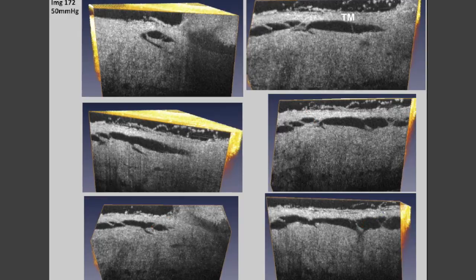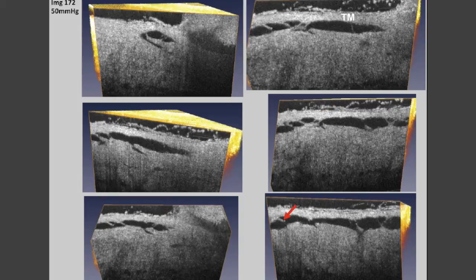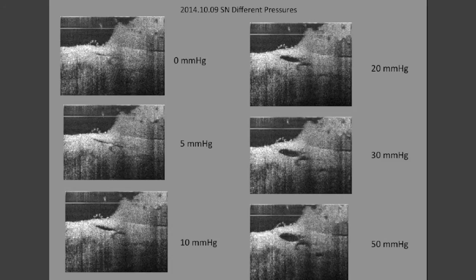Of even more interest though is the presence of cylindrical attachment structures which connect the trabecular meshwork with the hinged scleral flaps. We see multiple such structures here, and because the structures are hinged together and connected together, any movement of the trabecular meshwork will induce movement of the flaps.